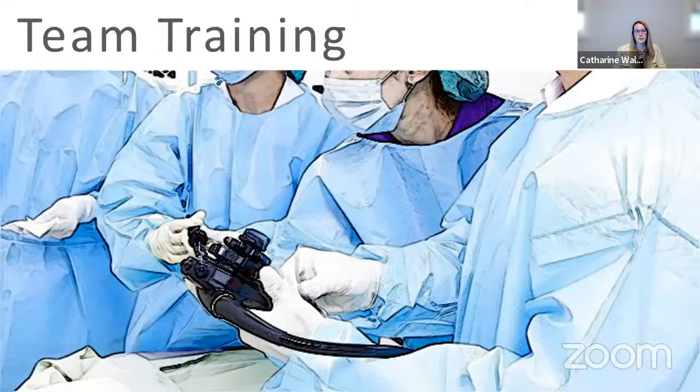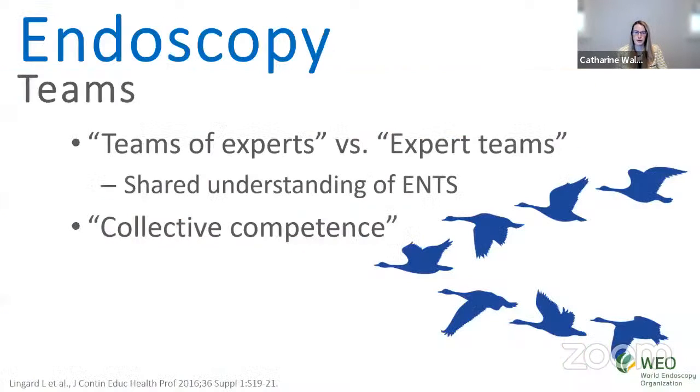So now that we've looked at what evidence exists in regard to novice trainees or training at an individual level, another strategy is around team training. And I would argue that successful high quality endoscopy services really starts with effective teamwork and leadership. And practicing clinicians should implement training for all members of the team so that they know their assigned tasks and can work in a cohesive manner.